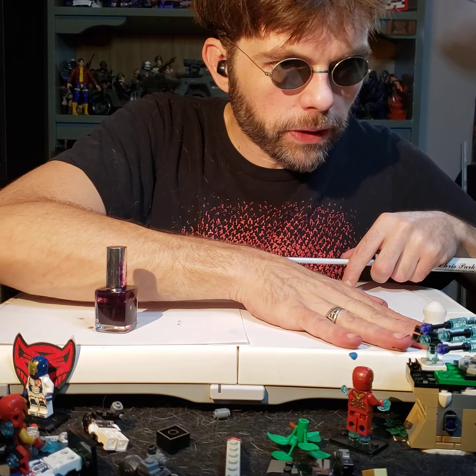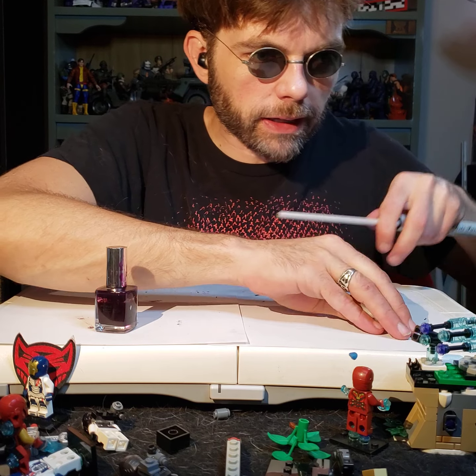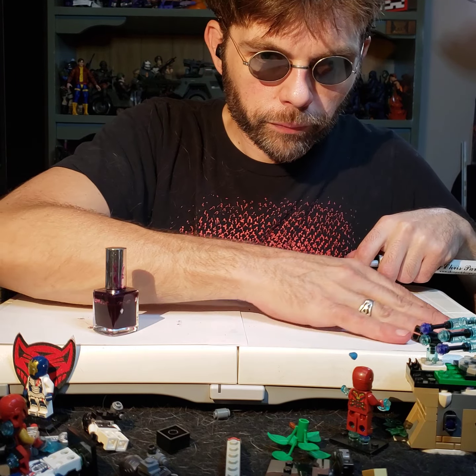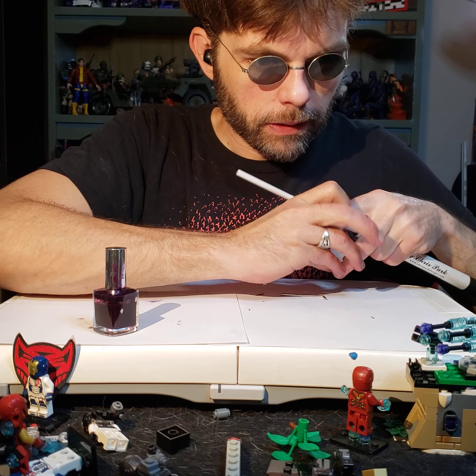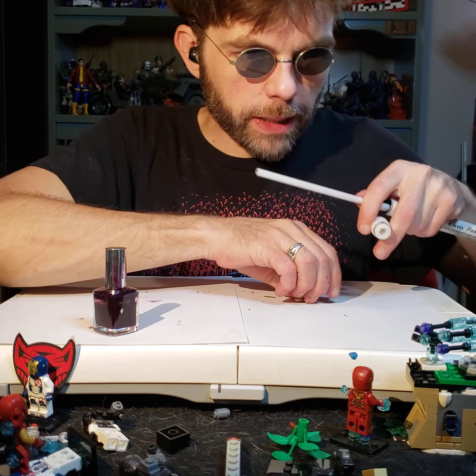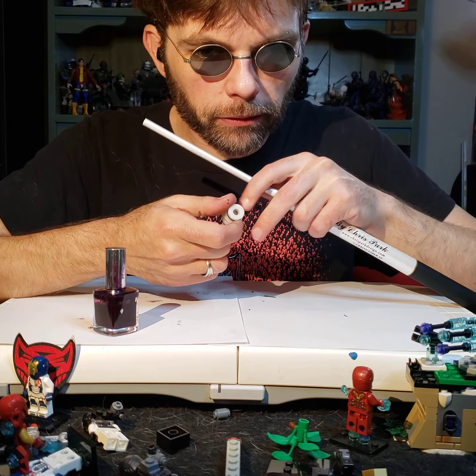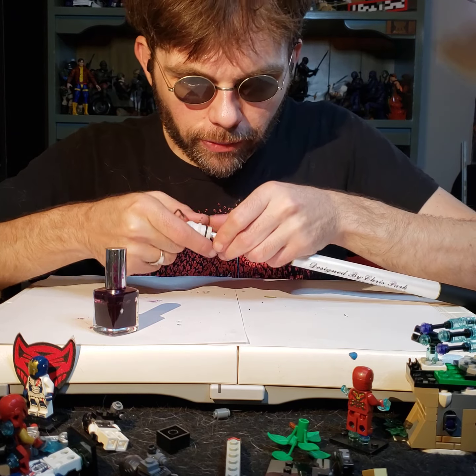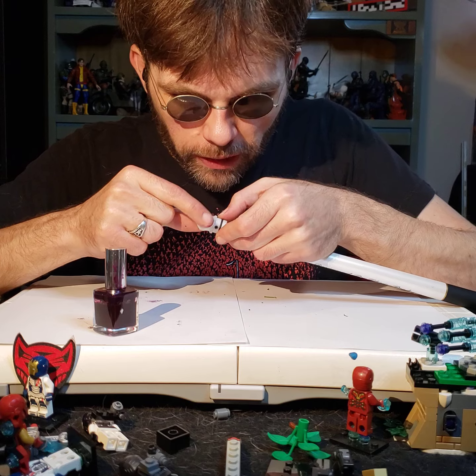Let's see. Did I screw up again and not put... I did it again. Oh, man. I am terrible about this. Where did I put that Allen wrench? I keep telling you to put your Allen wrench in the spot, and I keep failing at doing the exact thing I'm telling you to do. Such a hypocritical act of me.